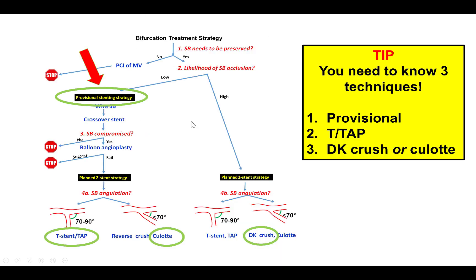So the plan has changed now. This is essentially a 010 bifurcation, and the provisional technique was selected.